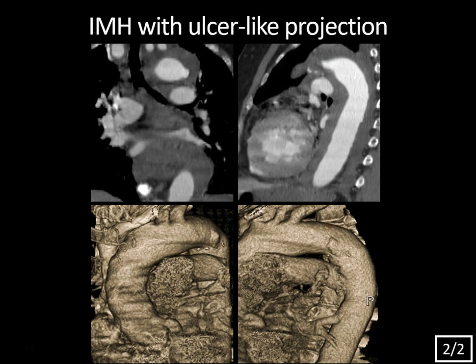So this is an intramural hematoma with an ulcer-like projection. When you see an ulcer-like projection like this, it indicates there is actually a small intimal tear or intimal injury with associated blood flow protruding into the media. You see this most commonly in the ascending aorta and the aortic arch, like in this case. It's an important finding to detect because there is a risk that this ulcer could enlarge and rupture, and it can also evolve into a dissection or an aneurysm. So whenever you see an ulcer-like projection, it's usually an indicator for treatment of the intramural hematoma, even if that hematoma otherwise has non-aggressive features.